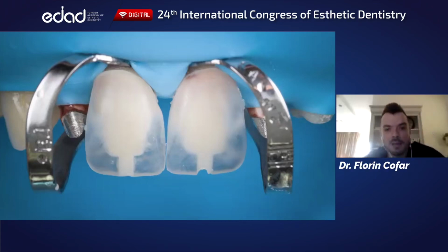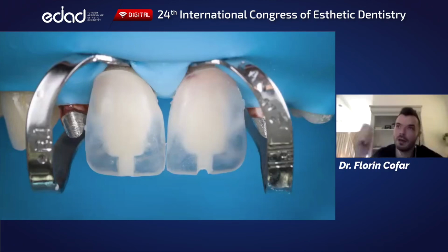And then, going back to the two chamfers now, because I have two chamfers, these copings will always have one position. If I would only prep one, it would be wiggling around and you would not be sure how to position it. And then you could lose all the work.